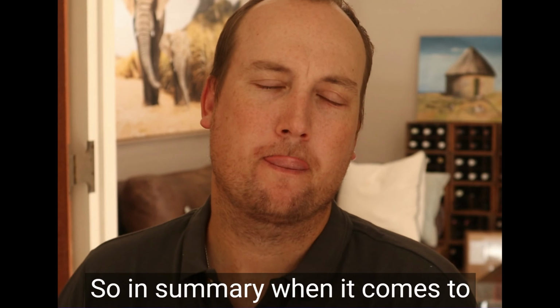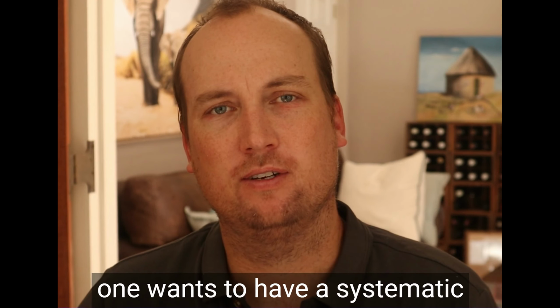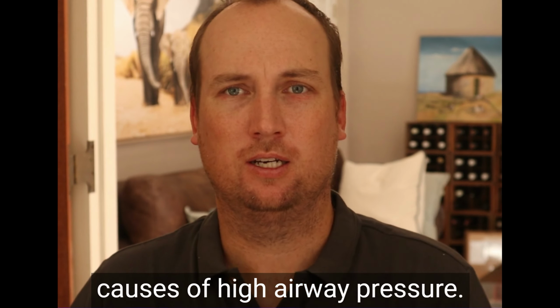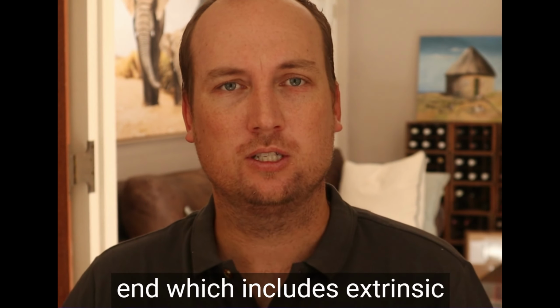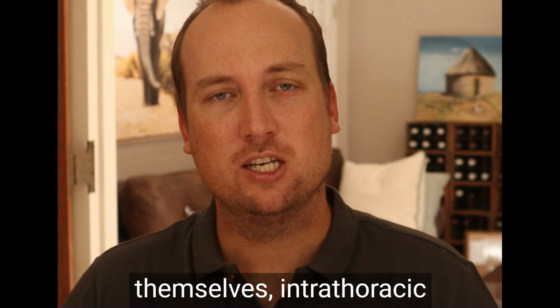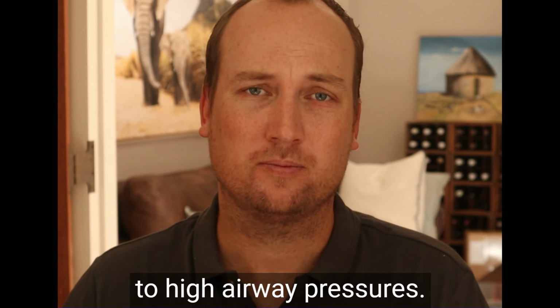So in summary, when it comes to high peak inspiratory pressures, one wants to have a systematic way of assessing all possible causes of high airway pressure, starting normally at the patient end, which includes extrinsic factors that may be compressing the lungs, the lung parenchyma themselves, and intrathoracic problems that may contribute to high airway pressures.